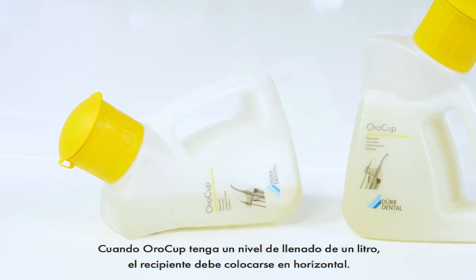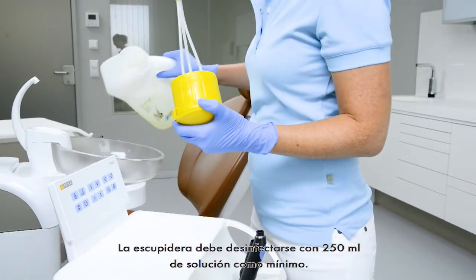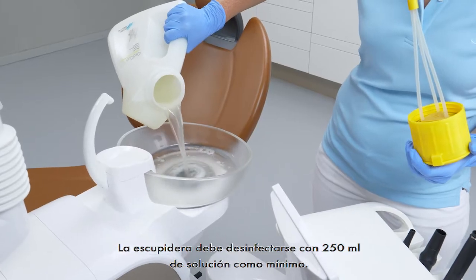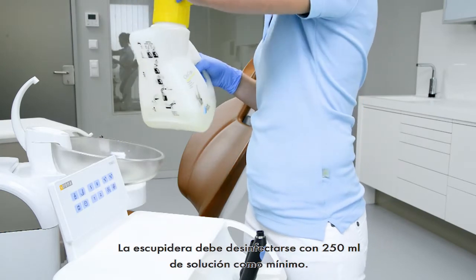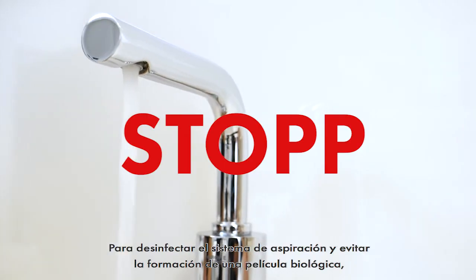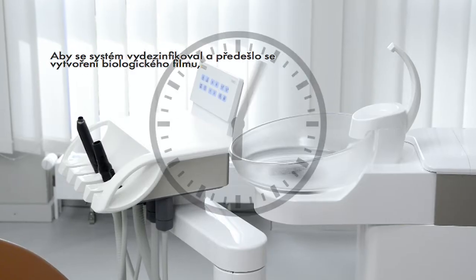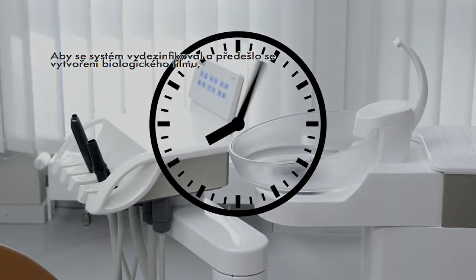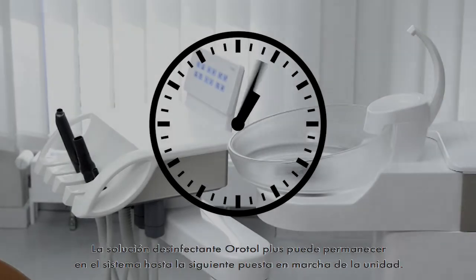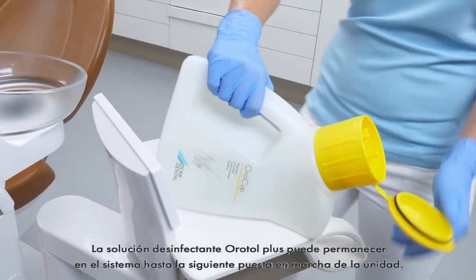With a filling level of 1 litre, the OroCup must be positioned horizontally. The spittoon should be disinfected with at least 250 millilitres of solution. The system must not be rinsed with water during the exposure time. The exposure time specified by the manufacturer must be observed to disinfect the suction system and to prevent the formation of biofilm. The disinfection solution OroTol Plus can remain in the system until the next restart of the assembly.